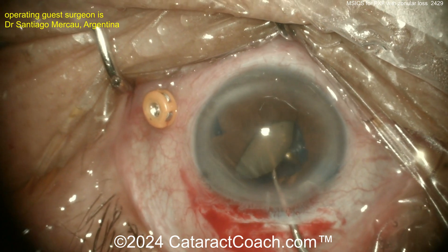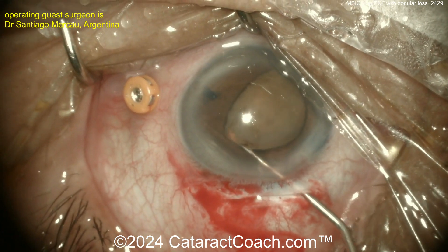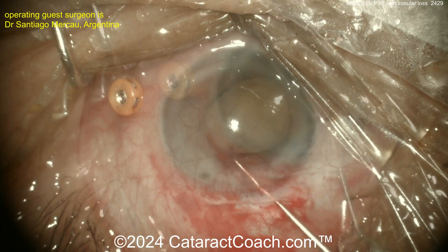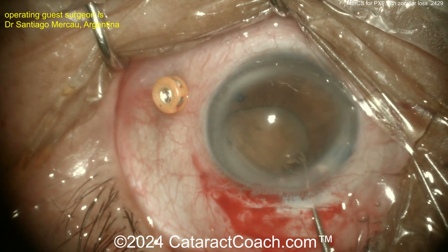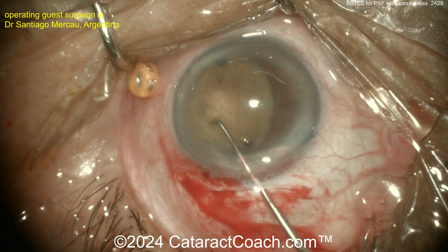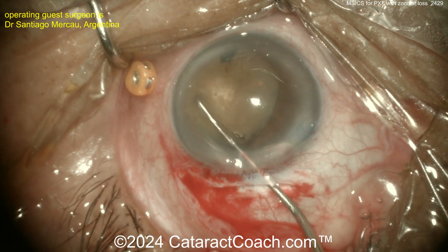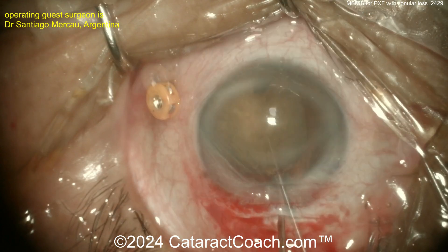Once you get this up in the anterior chamber you can extract the whole nucleus. All phaco surgeons should be able to do a beautiful MSICS procedure — if you don't know how, you've got to learn it. The onus is on you. Go to the CataractCoach website — I have videos exactly to teach phaco surgeons how to learn MSICS.